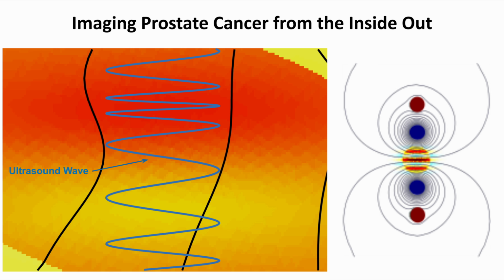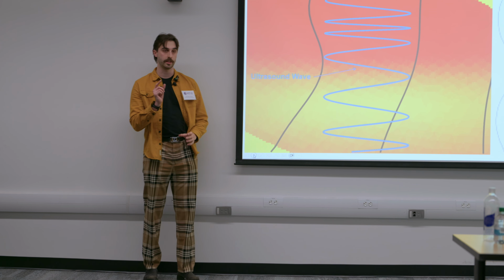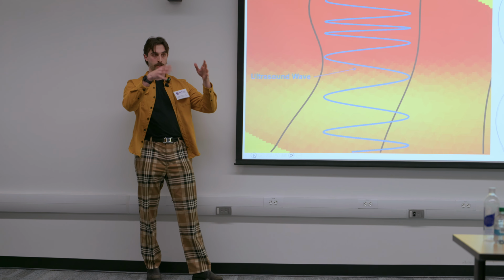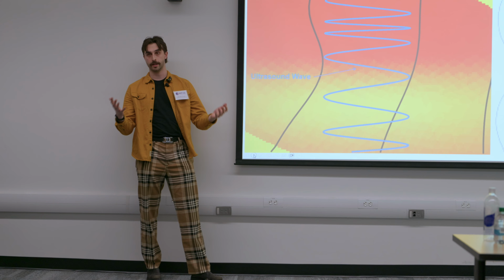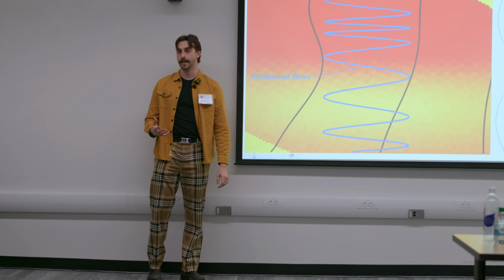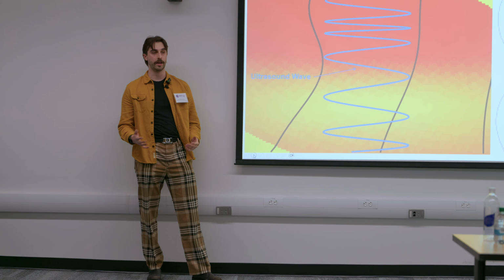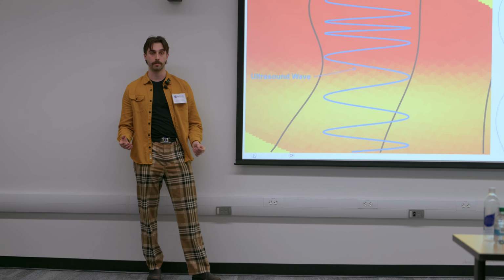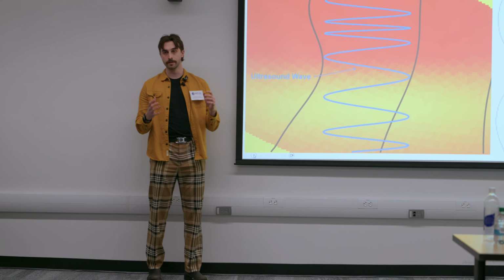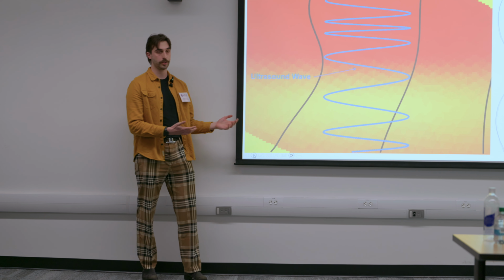By only adding small sensors to the needle that will be used to perform the biopsy, these changes can be measured, and the ultrasound can be used to scan the entire region, forming an image of what the tissue looks like. The reason why this is so important is because cancerous tissue is vastly different from healthy tissue due to the nutrient requirements and other growth factors it undergoes when it's forming. Using this, an image can be formed.